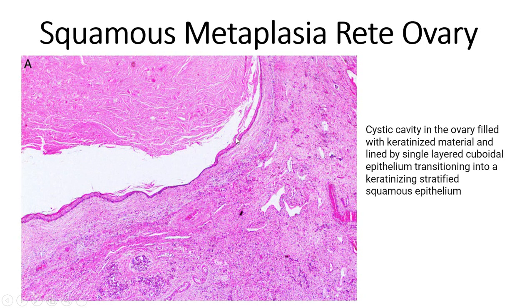It's like this one here, and even the cyst is filled with this one here, the keratin materials.